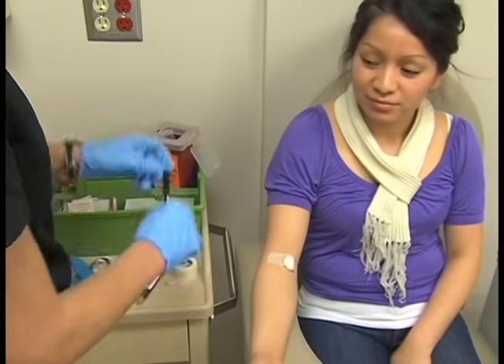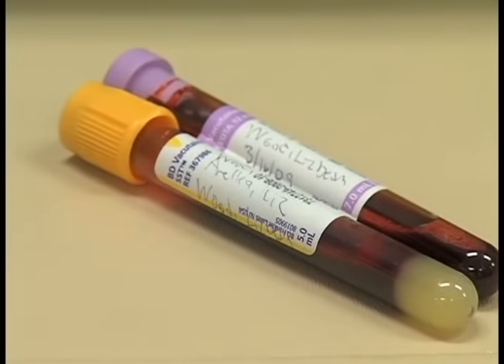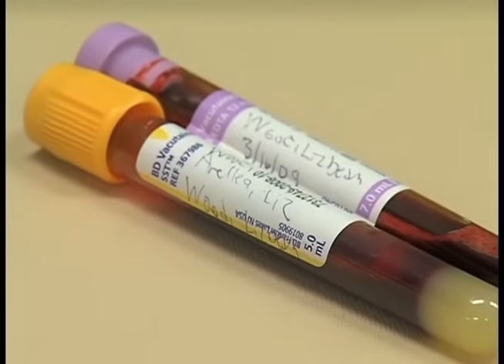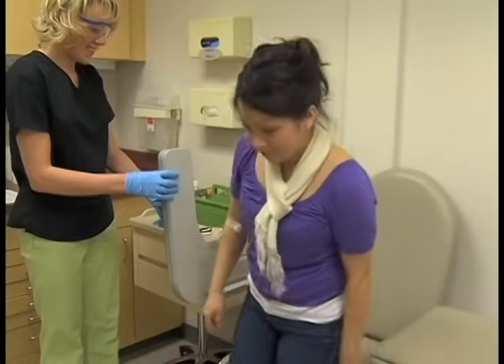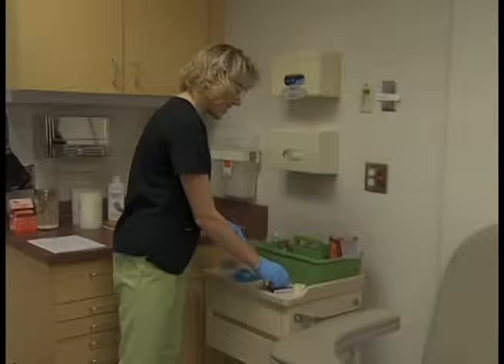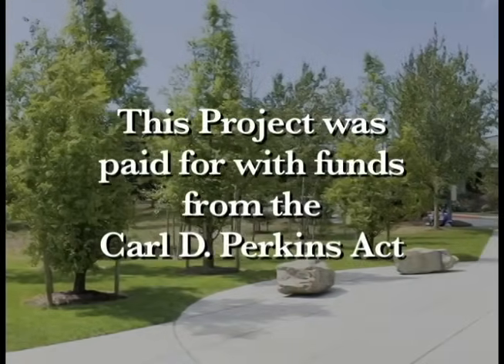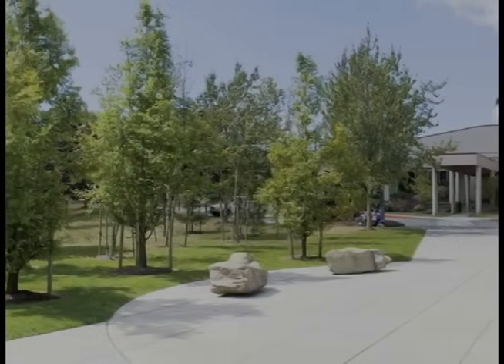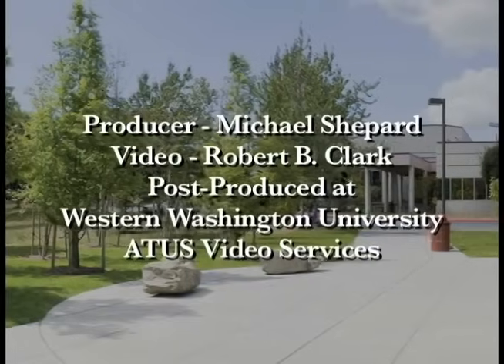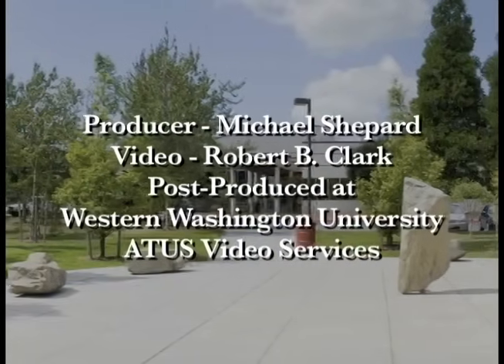Label the tubes with the patient's first and last name, date of birth, time the blood was drawn, and your initials. Make sure the patient is feeling fine — not dizzy or lightheaded — before they stand.